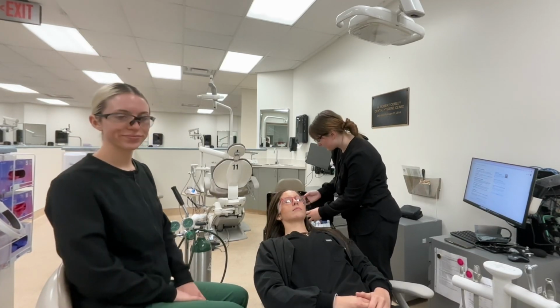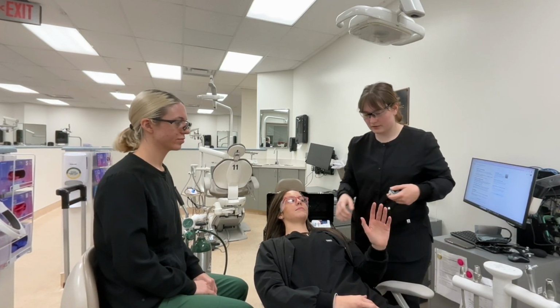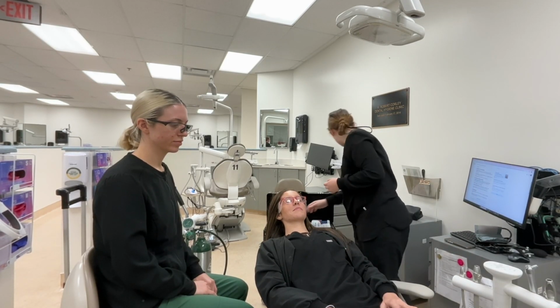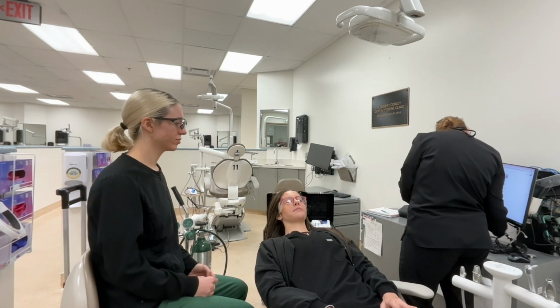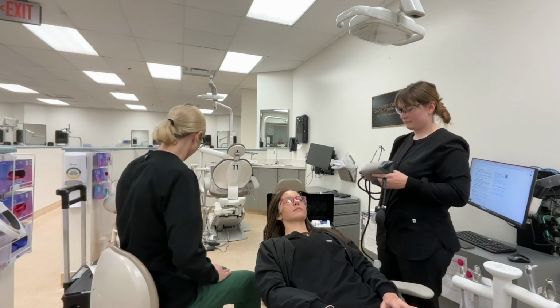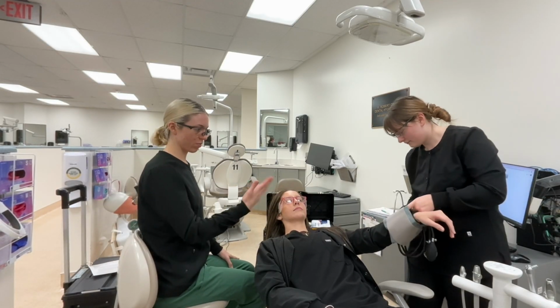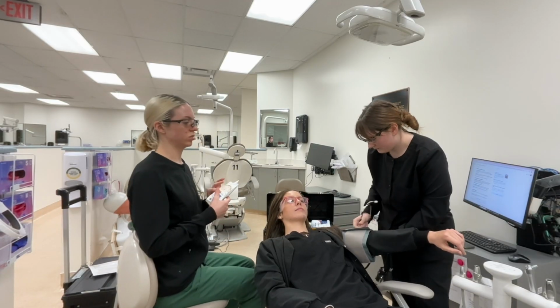Okay, so I'm going to go ahead and start by checking her vitals. So we're going to put the pulse ox on her pointer finger. I'm going to use this one. Get that going. And we're also going to go ahead and check her blood pressure. And since we're pretty sure that it is hypoglycemia based on the medical history, the other person, one of the two that's not doing the vitals, would go ahead and administer glucose.